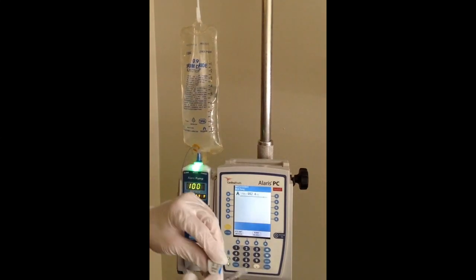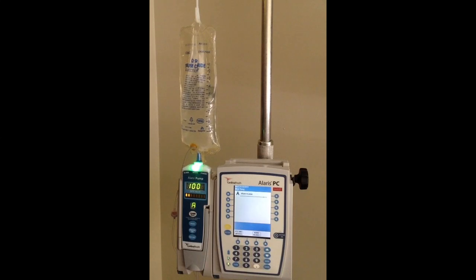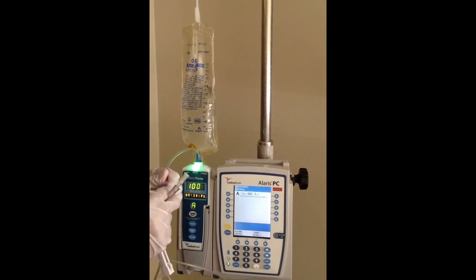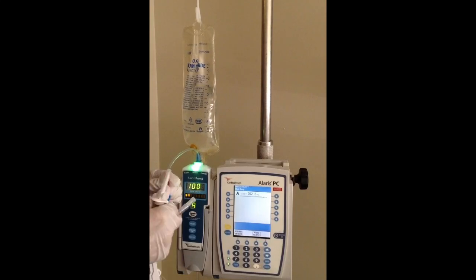The first step we're going to do before we connect our tubing is scrub our port. We're going to do at least 8 turns or 10 seconds.